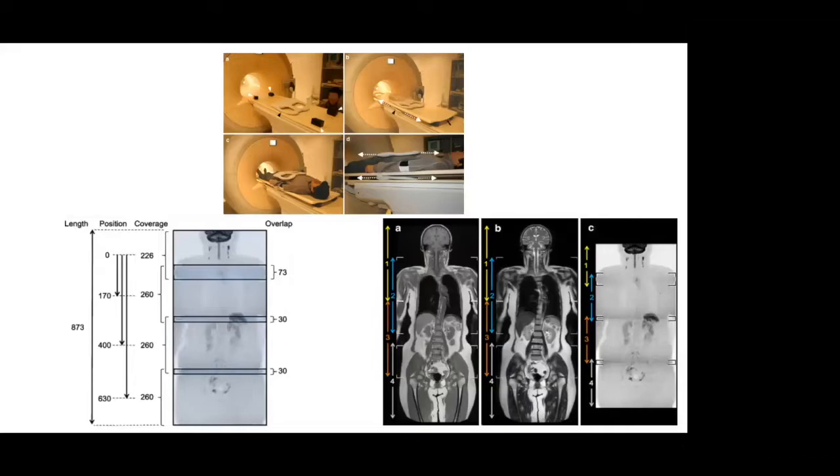quite new. In this paper from 2000, that long ago, they were quite excited to present this new table, which would slide. Instead of repositioning the patient, the radiographer would just come in after every station and replace the surface coil, one on the top and one on the posterior end, which you can just reposition, to get these lovely images. Now, of course, this has completely changed. The coils are built into the table, and now we're able to get really nice and relatively quick whole body imaging.